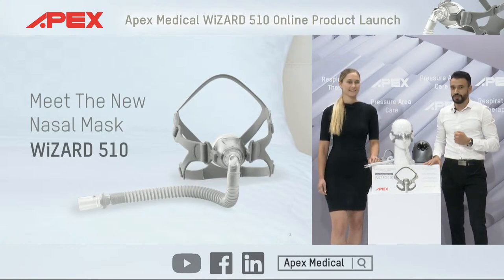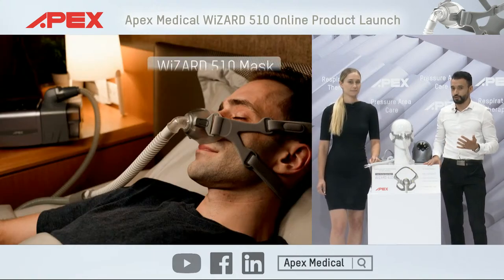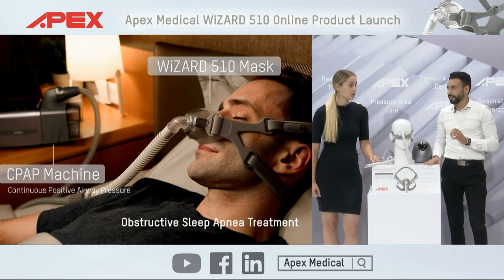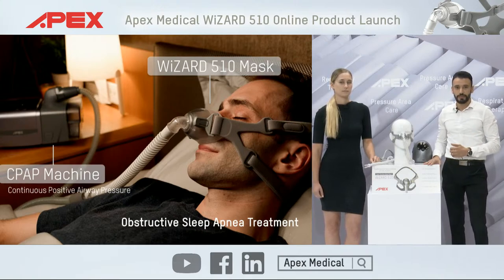The mask can be used with the CPAP machine to treat sleep apnea patients whose airway becomes partially or completely blocked many times during sleep. Does this mean that patients sometimes stop breathing and can't get enough oxygen while sleeping, but they couldn't even notice it? Yes, it is as horrible as it sounds. There are a few methods to treat sleep apnea, including having surgery and using a dental appliance. The American Academy of Sleep Medicine recommends that the best way to treat obstructive sleep apnea is to use a continuous positive airway pressure device, which is usually known as CPAP.